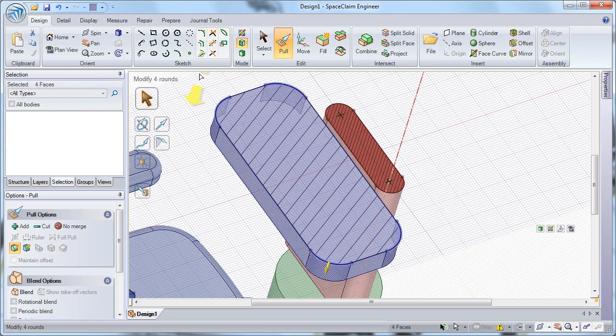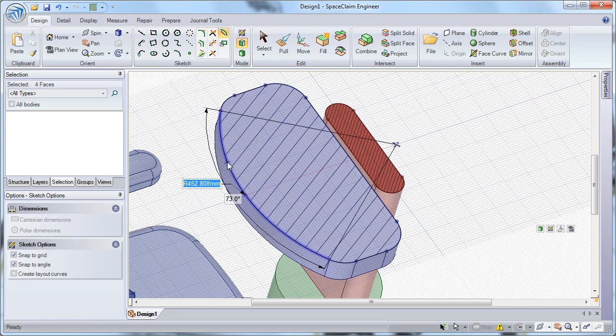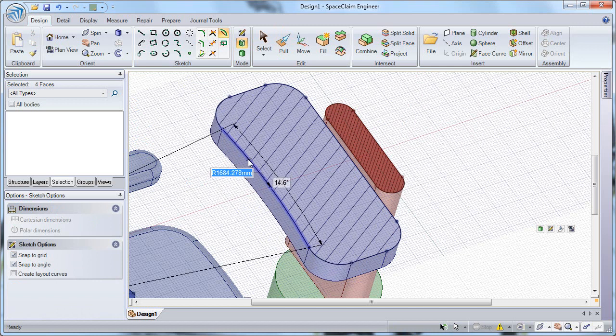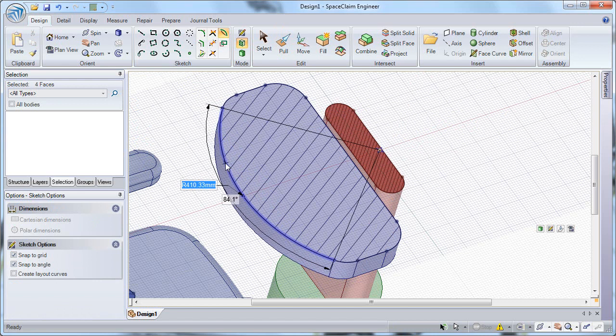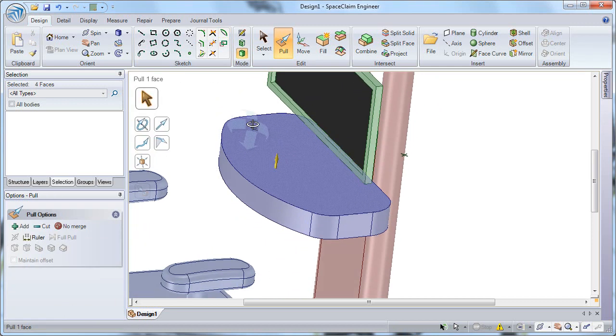I can also create a bend feature in section mode. Select on that front face of the table and click and drag with my left mouse button to bend that table in or out. Now we'll go back to 3D mode and make a few additional edits.